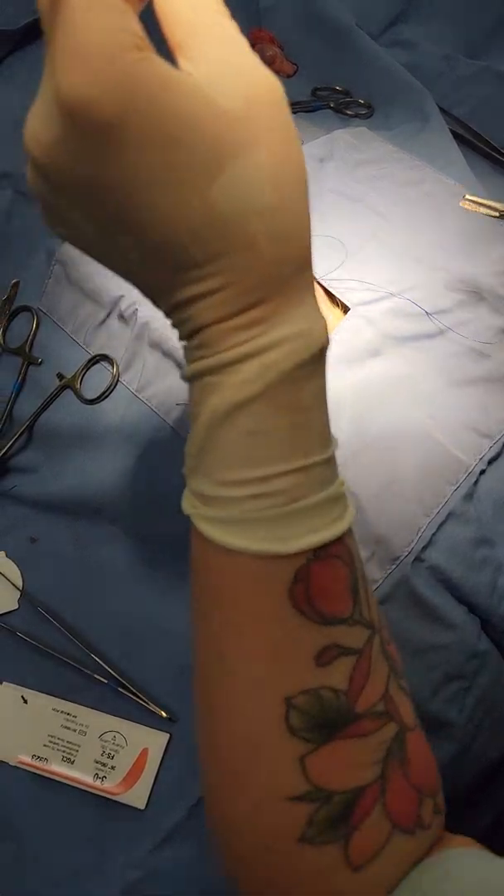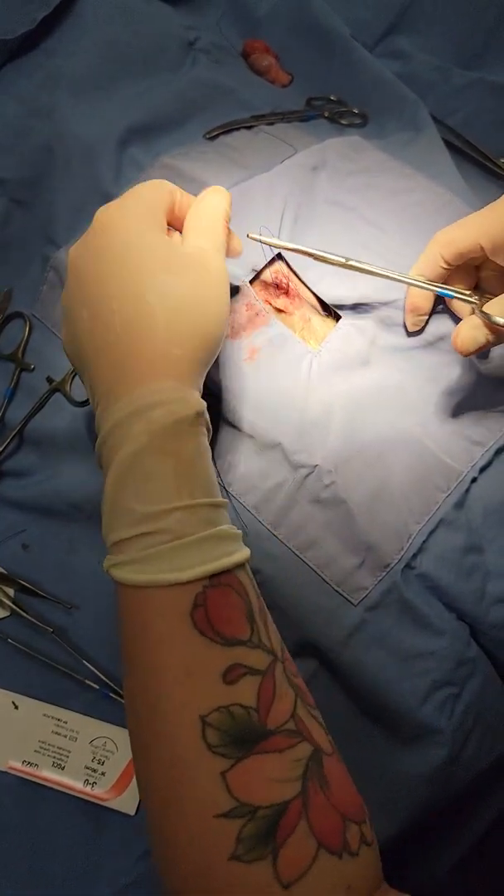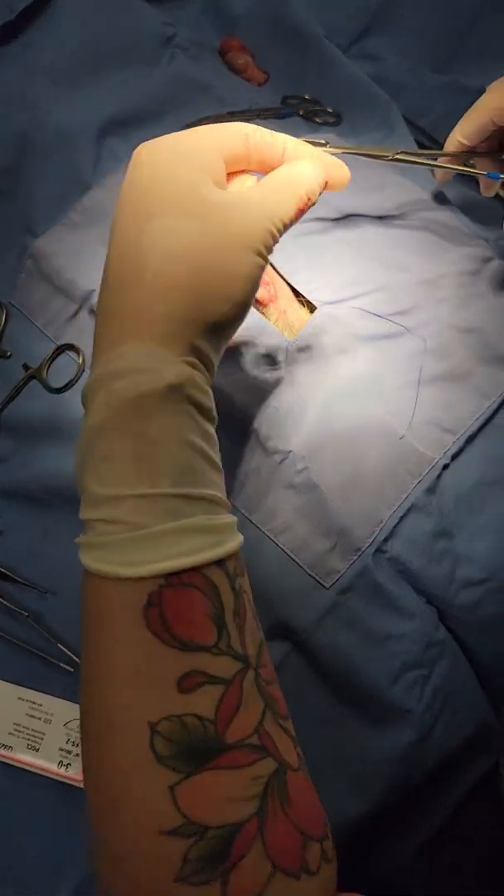And that is it. So I'm going to do an intradermal here, close my sub-Q with a little bit of glue, and that's it.